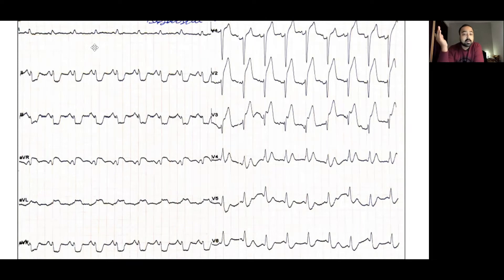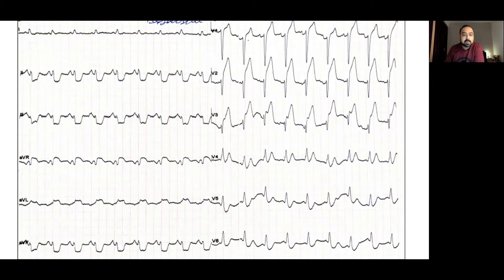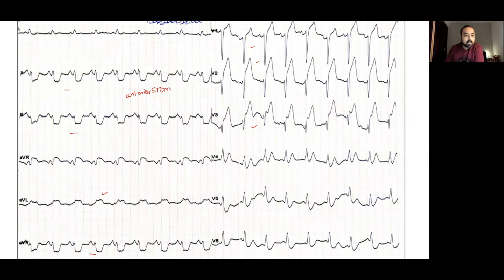Here is an example of a patient who presented to the emergency with chest pain of 4 hours duration. There are significant ST elevations in leads V1, V2, and V3, and ST depressions in leads 2, 3, and AVF. We can say this patient has an anterior STEMI with reciprocal ST depressions in the inferior leads.